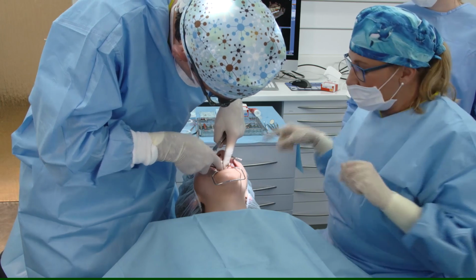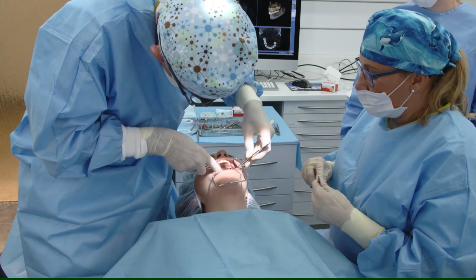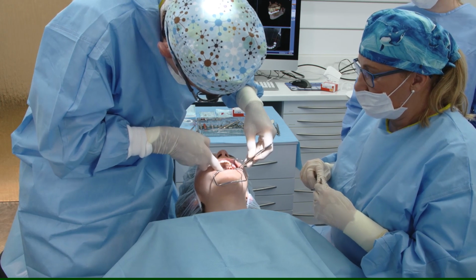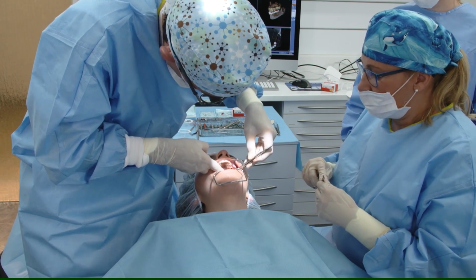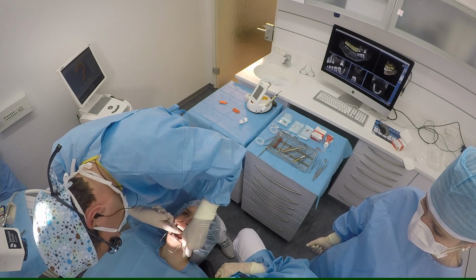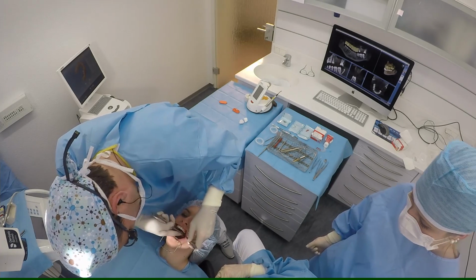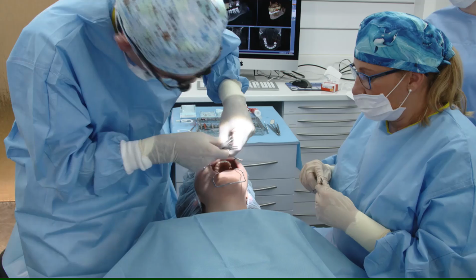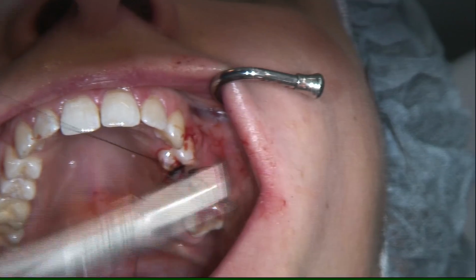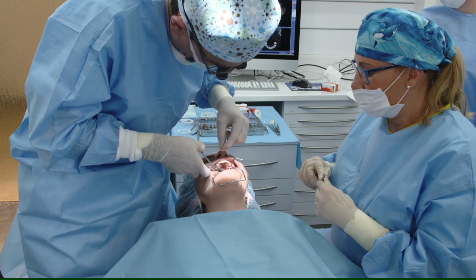And as I said before, we were placing an 11 millimeter implant and a 9.5 millimeter implant. Even recent studies show that implants with even smaller length are showing similar results to longer implants, also in the maxilla. So we don't need 15 millimeter implants anymore.